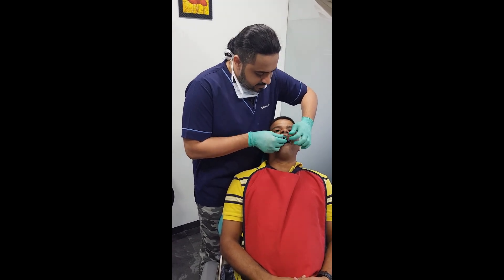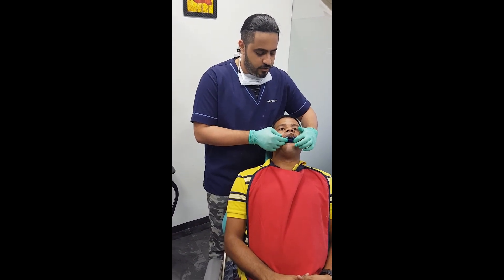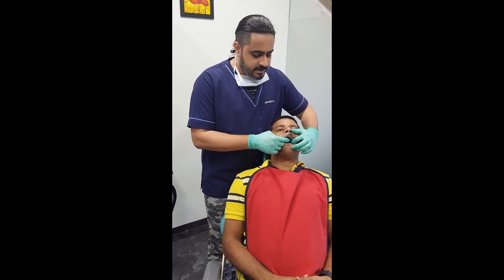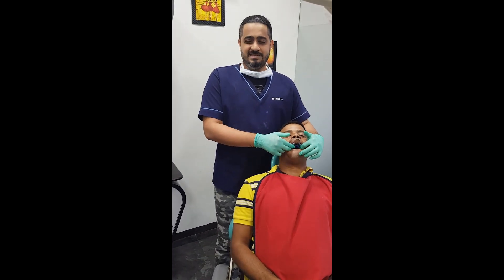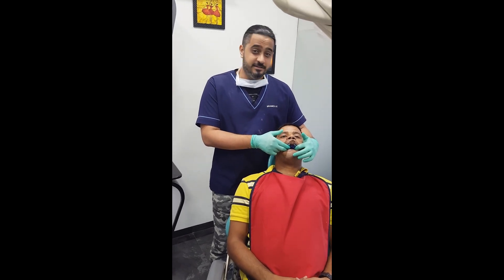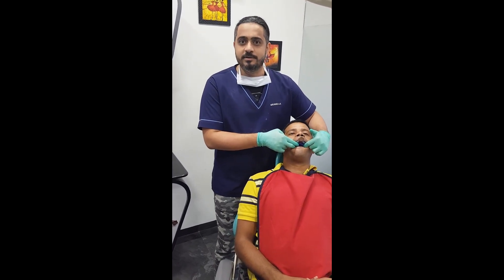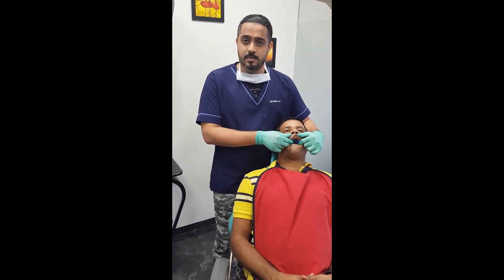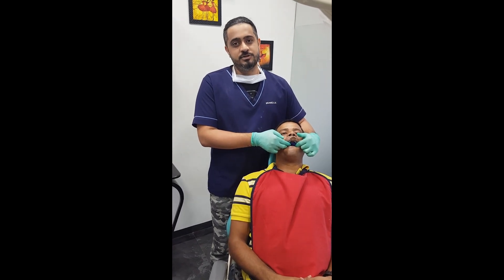Very gently. It's important that this time you do not over-press, because the light body will completely flow out and not stay in the critical areas. Now allow this material about four minutes to set. I personally prefer to keep a timer in front of the patient, because these four minutes can often be the slowest four minutes of the patient's life and the patient's mouth is just suspended open. It helps for the patient to know that when it beeps, that is when the four minutes are over and I will be removing the tray from the patient's mouth.